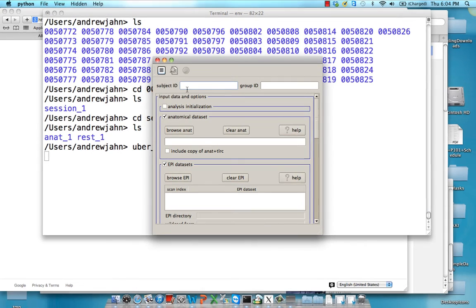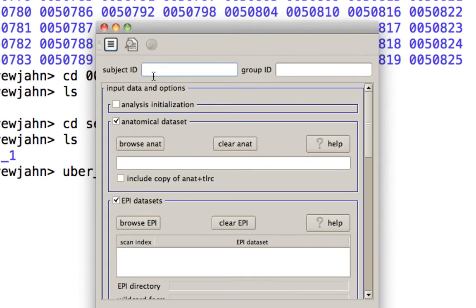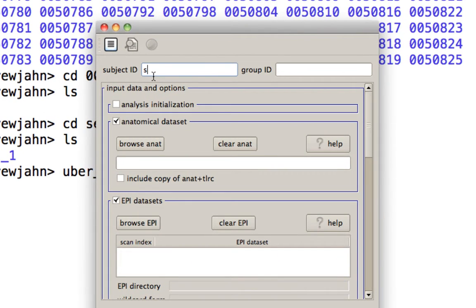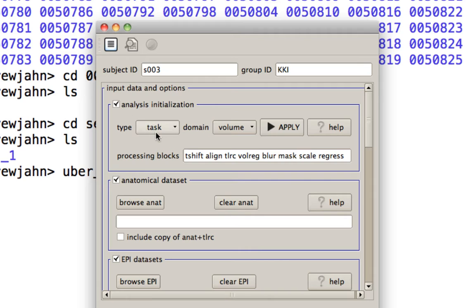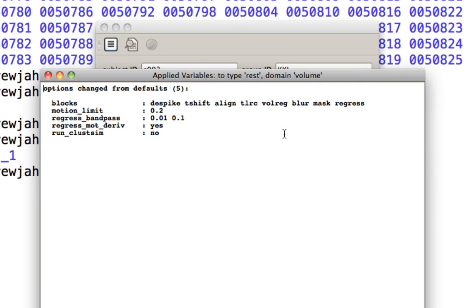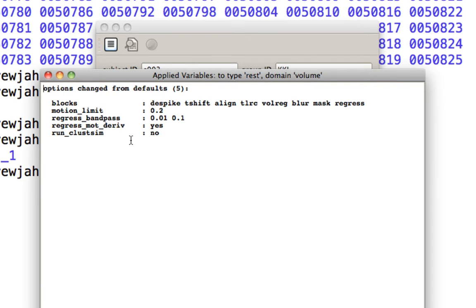Here's what it looks like. Subject ID, this is totally up to you. I'm just going to say like S003 and group ID KKI. Now here select analysis initialization, because instead of task, we're going to be selecting rest. After you've done that, hit apply.